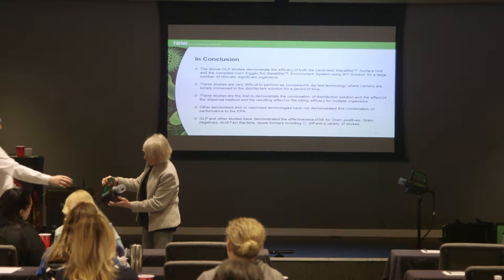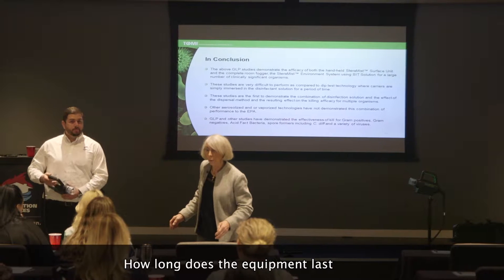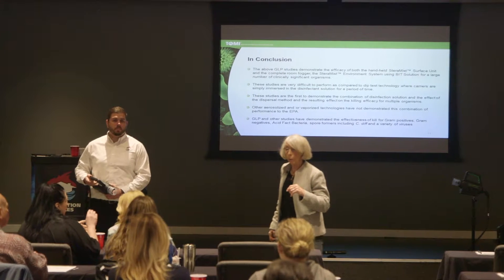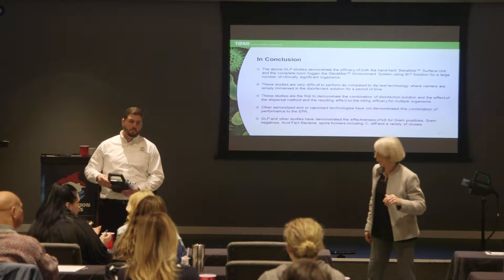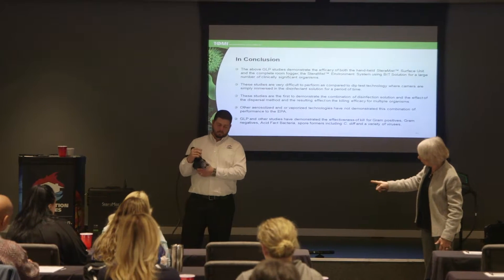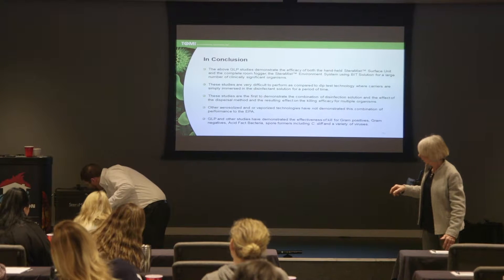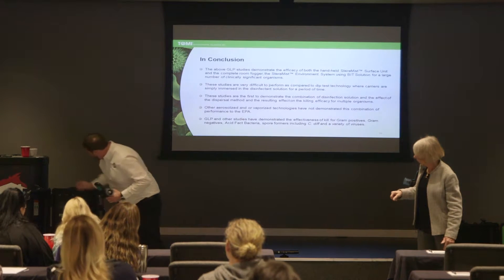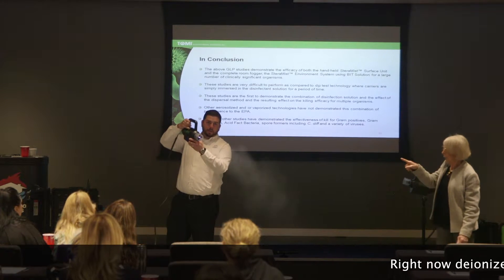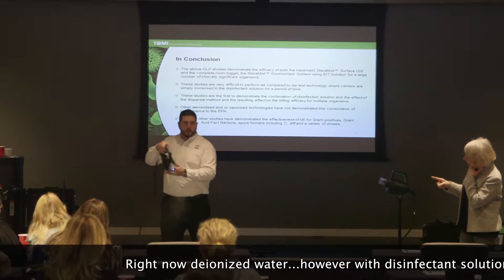We're going to turn this on and let you spray the machine. It just has to be calibrated once a year. Matt's going to show you — you have a hose, the solution is brought up, you prime the machine, and then it's ready to go. Basically it's point and shoot. You can see the arc coming through, and you'll see the water — right now it's just deionized water.